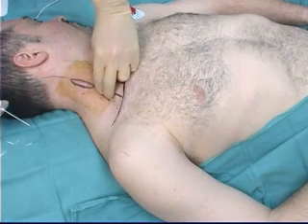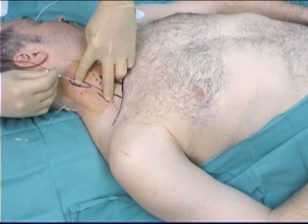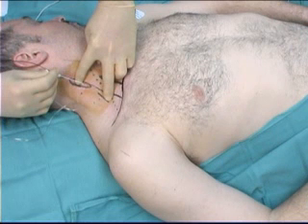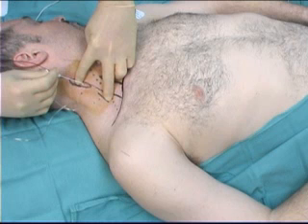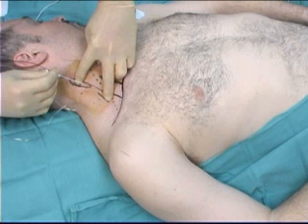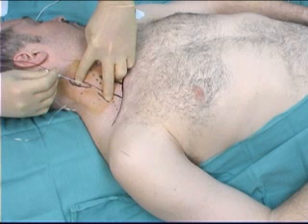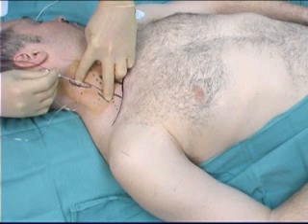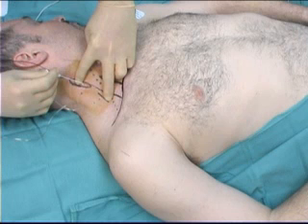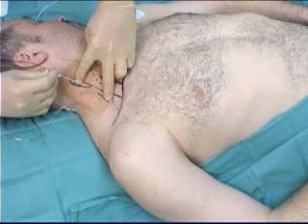The anesthesiologist stands at the head of the table facing the feet of the patient. The interscalene groove is palpated with the index and middle finger in the area of Winnie's point. These two fingers are split, leaving the middle finger in the interscalene groove. This causes congestion of the external jugular vein, making it easy to identify, while the index finger applies traction to tighten the skin.